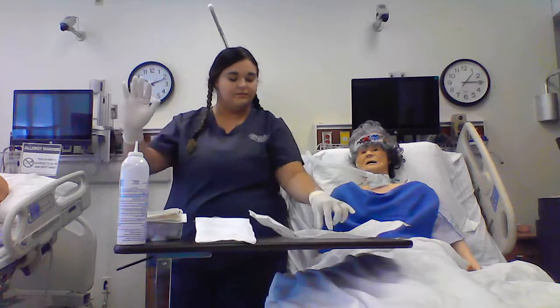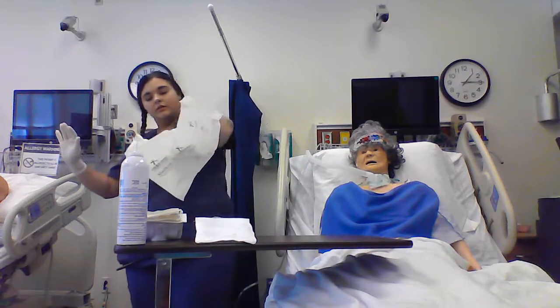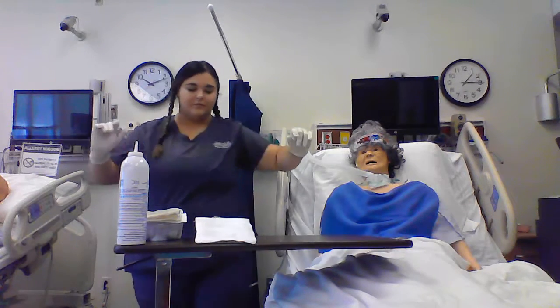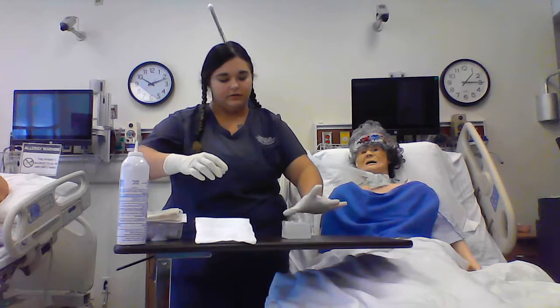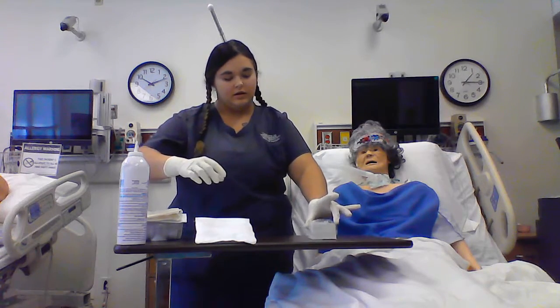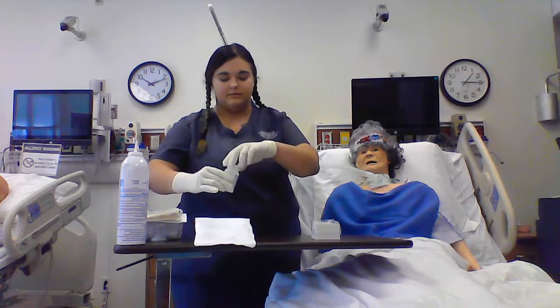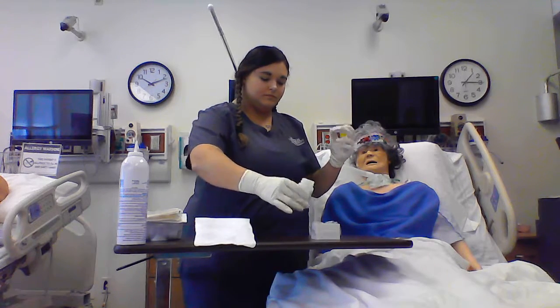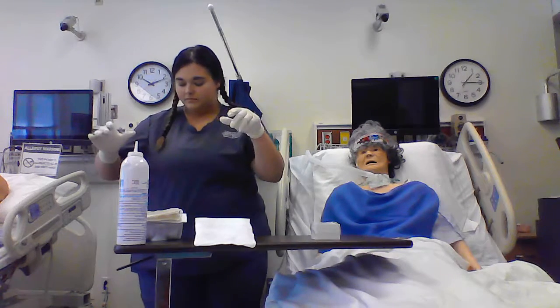Okay, so I'm sterile. I'm going to put that away. Okay. I'm going to take my little box here, and I'm going to put my sterile saline in it. Throw that away.